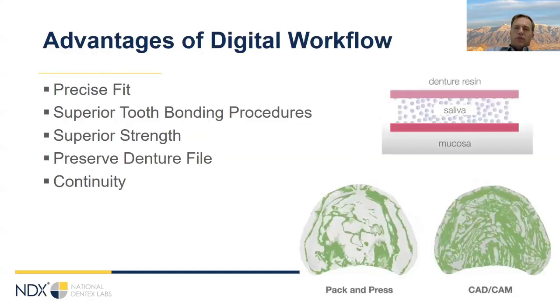So let's talk about what some of the advantages are of the digital workflow. With analog dentures, acrylic shrinks 8% during polymerization. There have been some advances in the chemistry, and we have injection molded dentures that help a little bit with that.